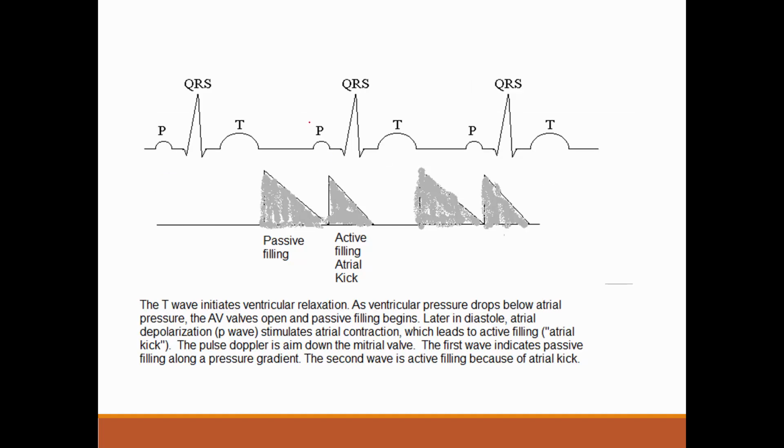Now with a pulse Doppler, we could put the point at the AV valves, and what Dr. Katz showed you in class was the mitral valve. Here's the thing.